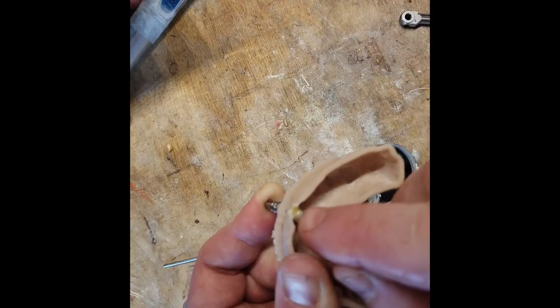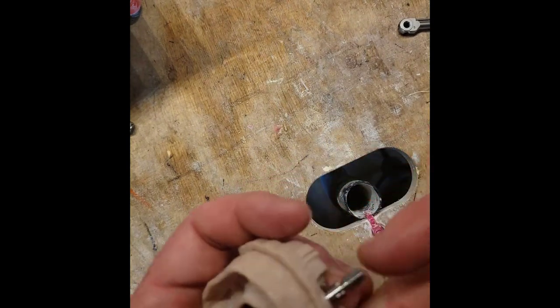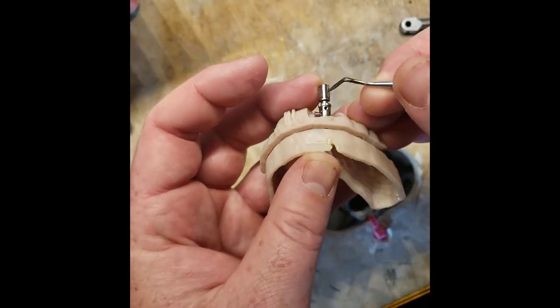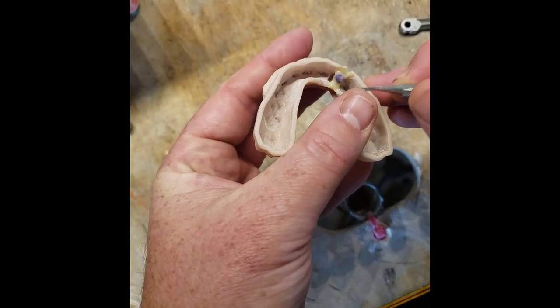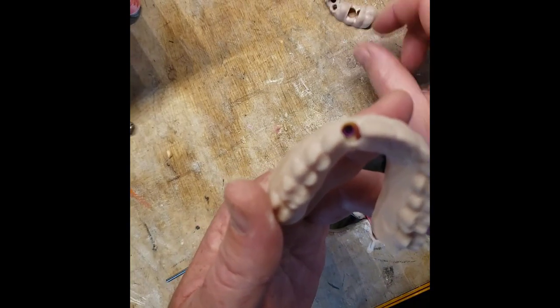I'll give it a little press to make sure everything is dialed in, then come in and cure the composite. Very quickly we now have a working model. The notch I pointed out is in perfect alignment with the little dot I created. With the analog in place and fixed — it's not mobile — we can disengage the driver and now we have a working model.